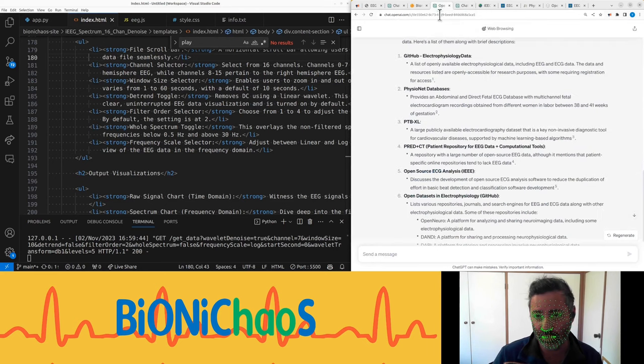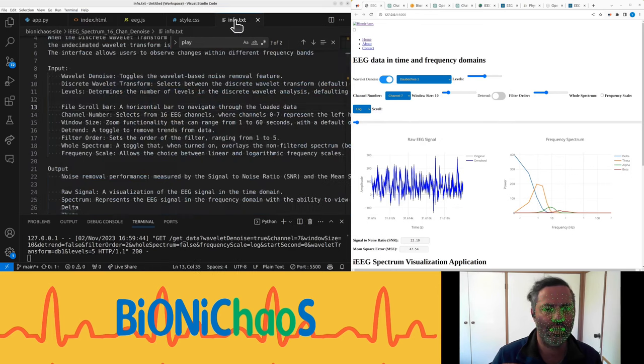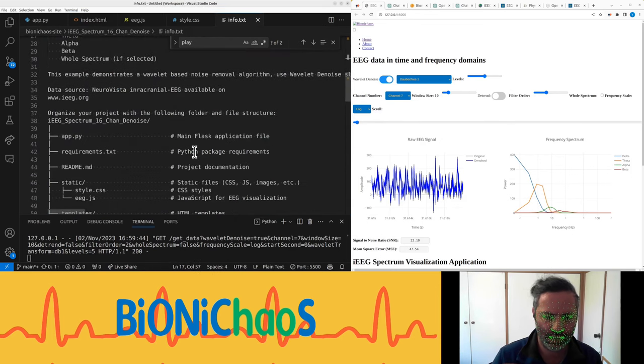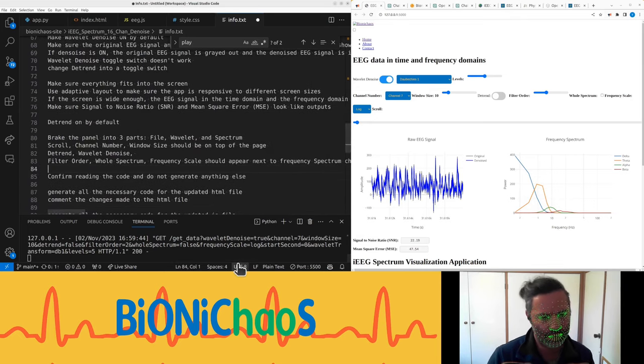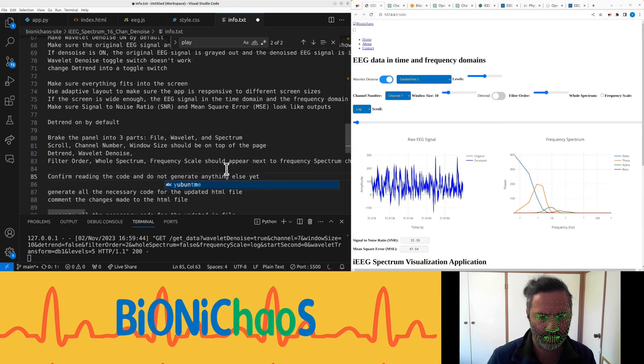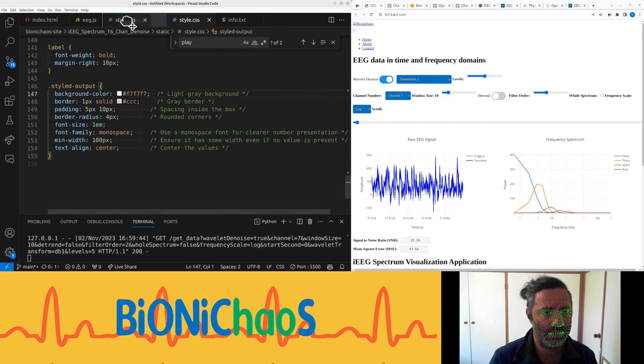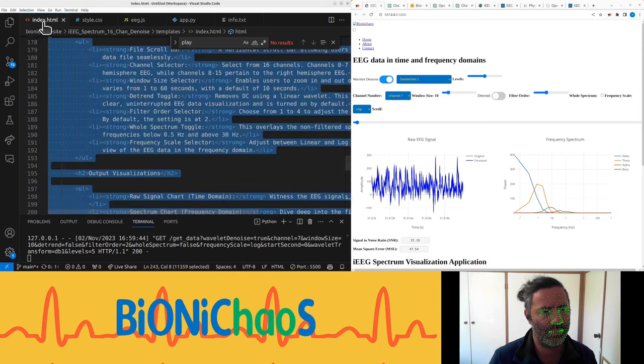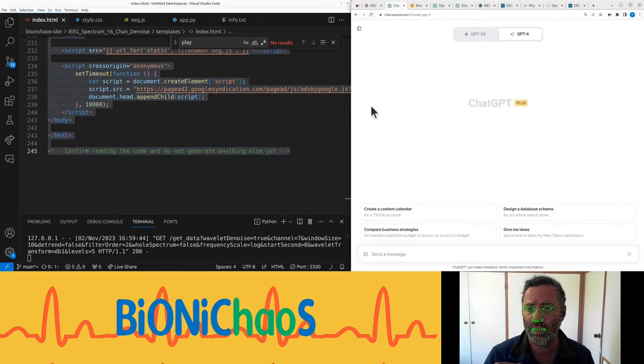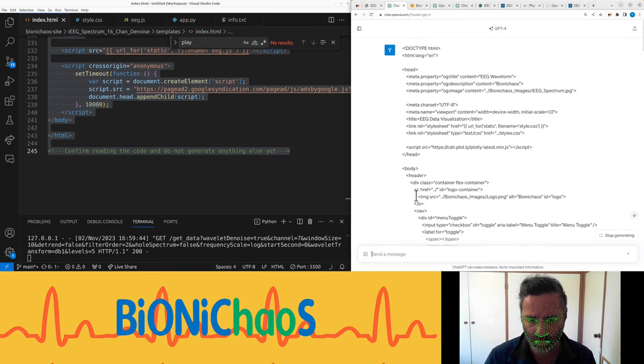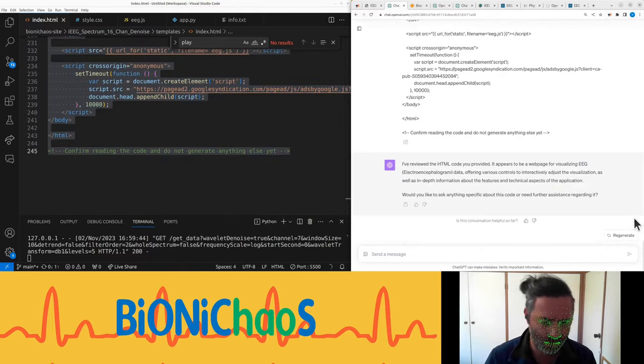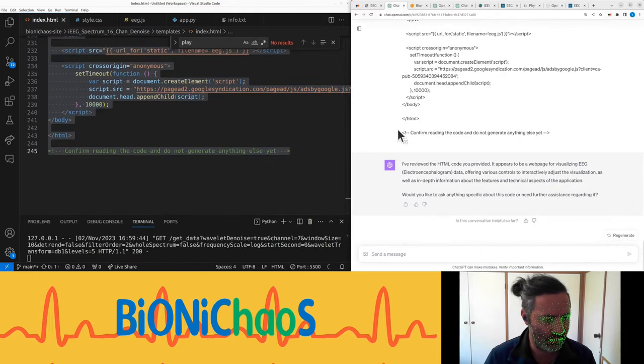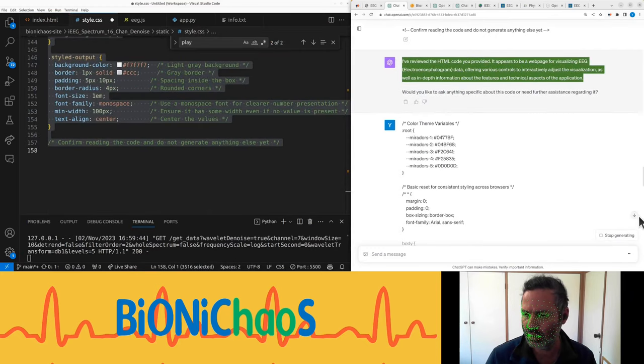The link is legit. Yeah, I think anyone can log in and look at some data they have in the online viewer as well. Let's get back to this one thing. When we're putting it as prompts into GPT, I want to show, we want to put this at the bottom: confirm reading the code and do not generate anything else yet. We'll do the Python last, CSS after HTML.